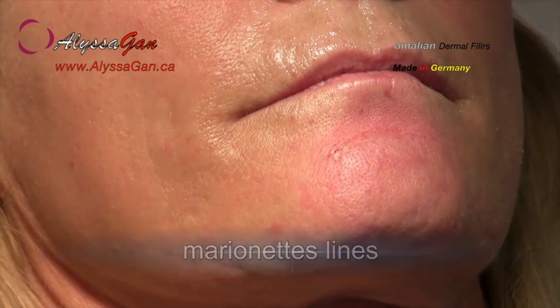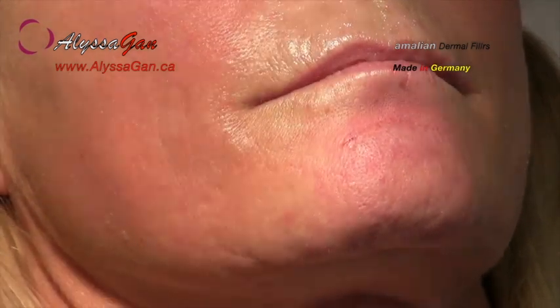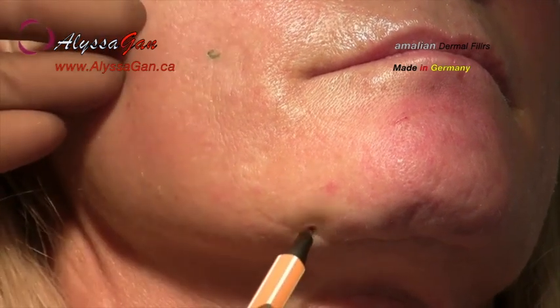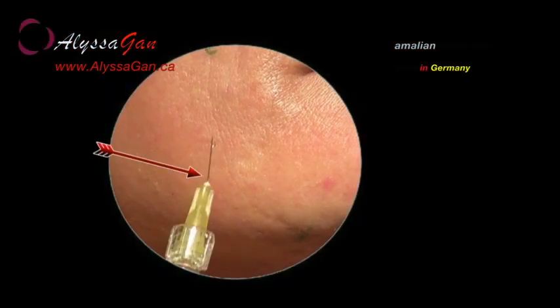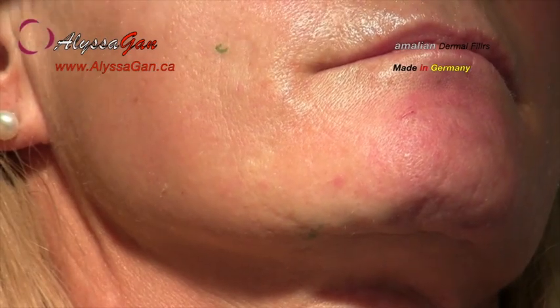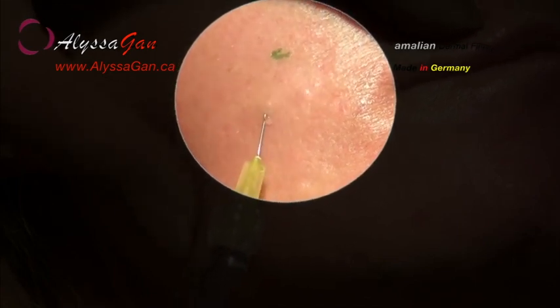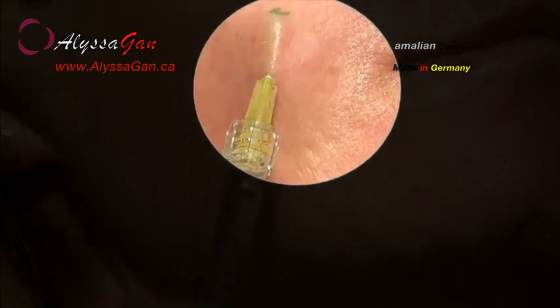Fine cheek wrinkles are best visible when the patient smiles. As this is a very superficial injection, the needle is held incline. This makes it easier to realize an optimal injection angle. Marking the beginning and end of the wrinkle makes orientation during the treatment easier. For this very superficial injection, the tissue needs to be stretched tightly. This can be done either from within the mouth or, like here, from outside using 2 fingers to stretch the skin.